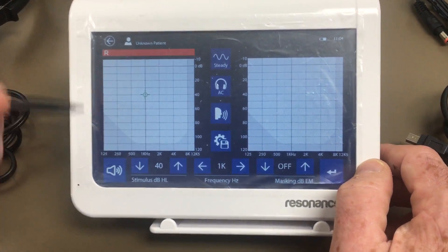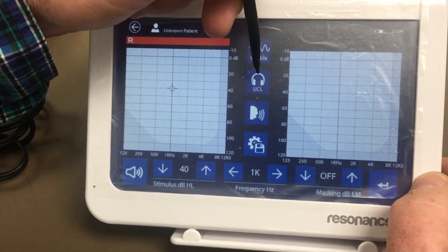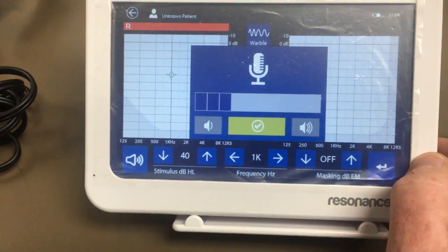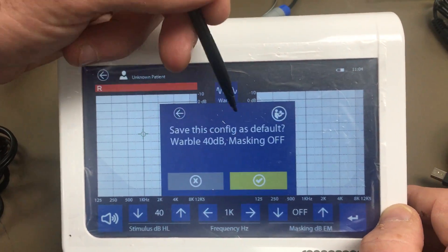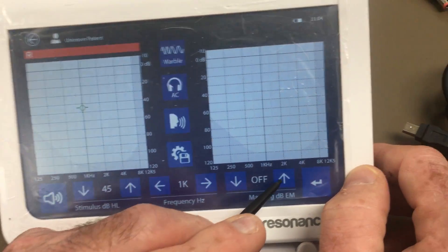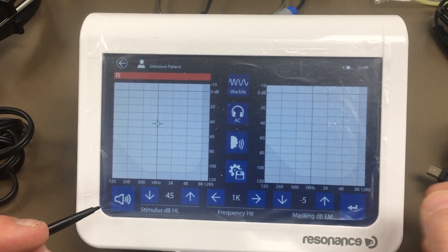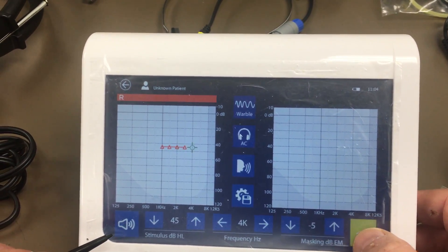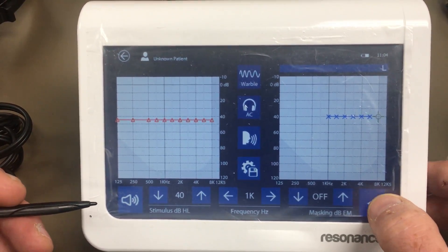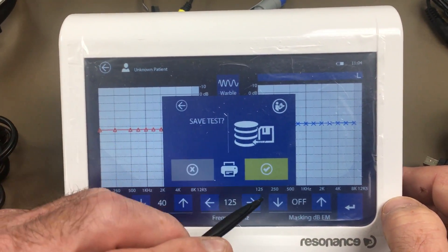In tone audiometry you have an option of choosing steady, pulse, or warble. You have your most uncomfortable level and your AC setting. You also have a talk-over feature — you can speak into the mic and it will go into the headphones. Here is where you change your dB level or frequency level. If you prefer to use masking, you would select that. You admit the tone, and if a patient raises their hand instead of using the patient response button, you just mark it. You click over to switch ears — you'll see it turns blue — then work through the other side the same way. When you go to click back, it will ask if you want to save the test; you click yes.